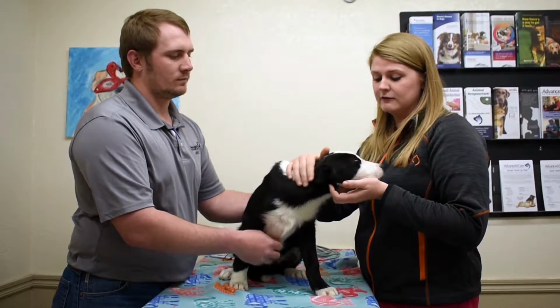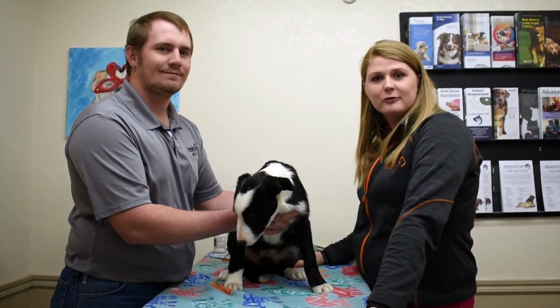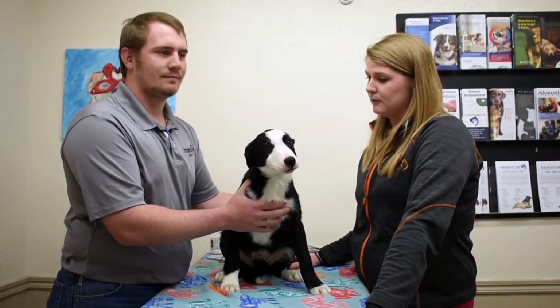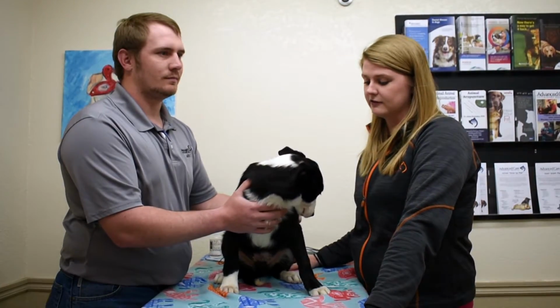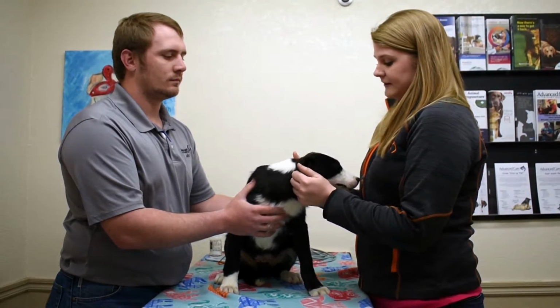So it's a good thing for certain breeds. I would say Border Collies are among the ones we do most frequently. The most common poster child would be Dalmatians that have some hearing issues, but there's lots of breeds with congenital deafness that we do lots of litter checks on. So we can also do this in adult dogs, and dogs that are under anesthesia will even respond to the test. So we're going to start attaching the leads here.